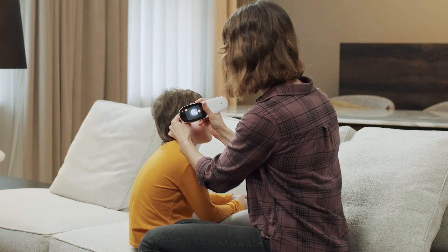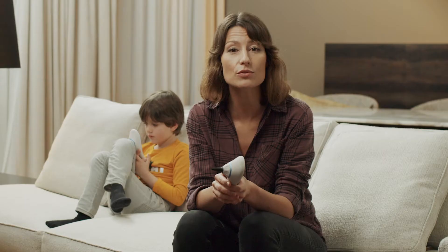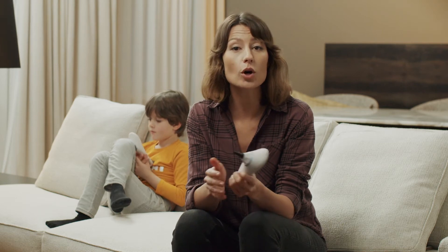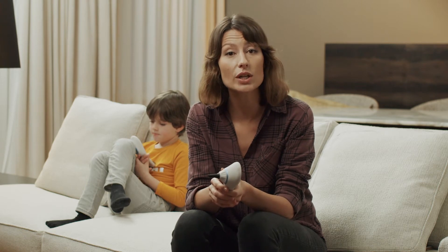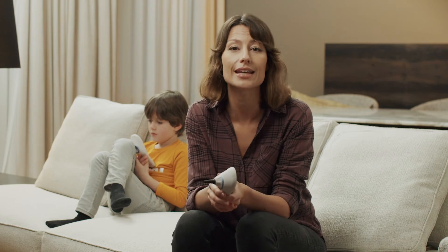Hold HIGO in a horizontal position, just like chopsticks, with your thumb on the top and the rest of your fingers on the bottom of the device. The grip optimises the positioning of the speculum during the examination, which in turn gives the examiner more opportunity to manoeuvre inside the ear canal. In addition, the fingers on the underside of the device can comfortably rest on the patient's head and create a natural distance that increases the safety of the examination while protecting against any unwanted movements.